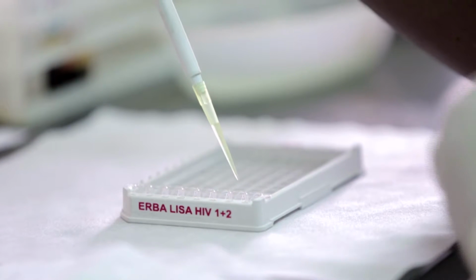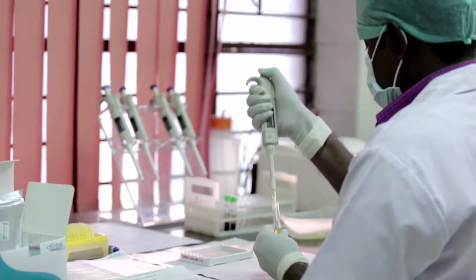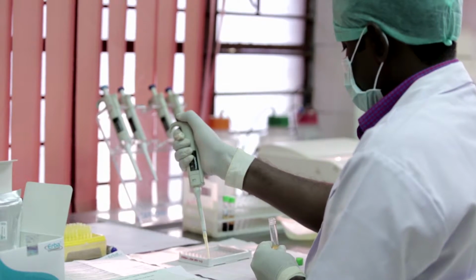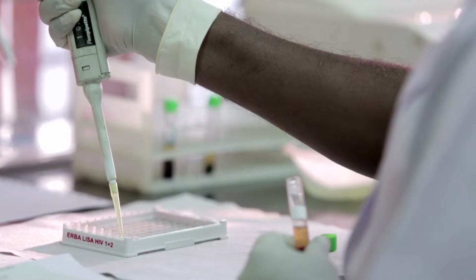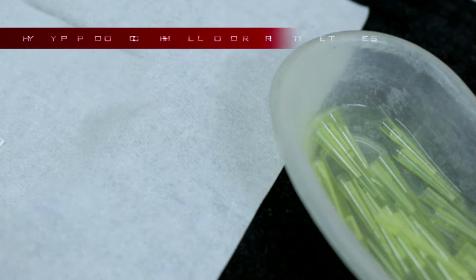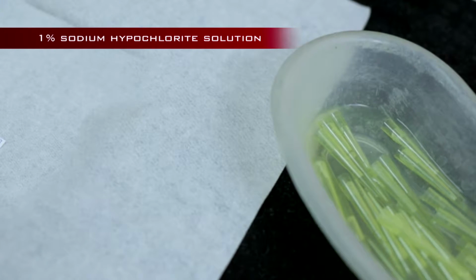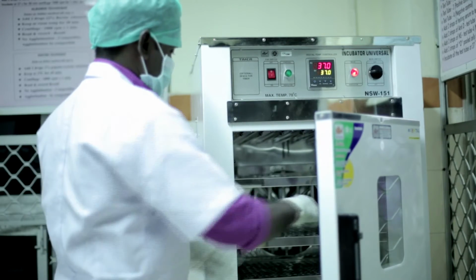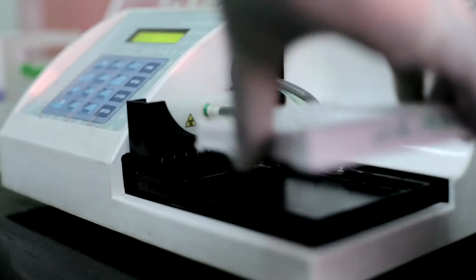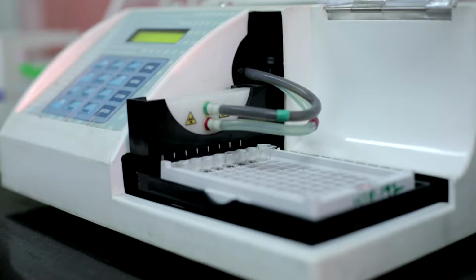Hold the micropipette vertically and dispense the samples into the wells. Do not touch the sides of the well to avoid cross-contamination. Make sure that tips are changed after dispensing each and every sample. Discard the tips in a kidney tray containing 1% sodium hypochlorite solution. Then incubate the microplate at temperature and duration as instructed. Now wash the microplate using ELISA washer as per kit literature.